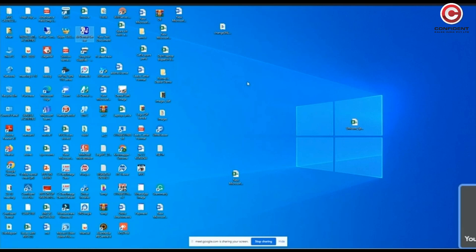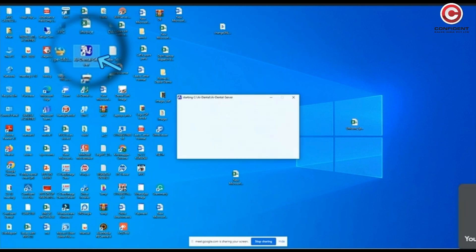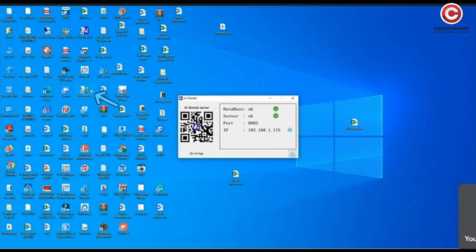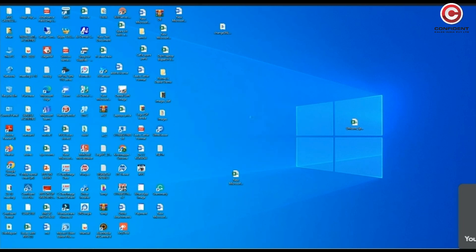After you install the application, you will find two icons on your desktop: AI Server and AI Dental. Start the AI Server by clicking on it. Once the server has started, minimize the window and click on the AI Dental application. You will find a login screen.